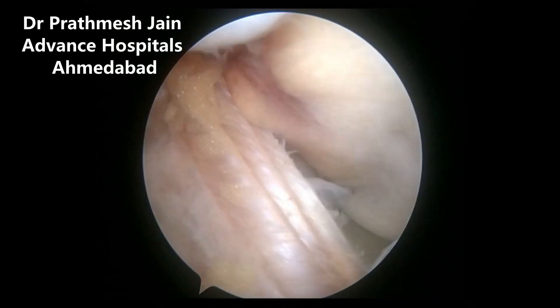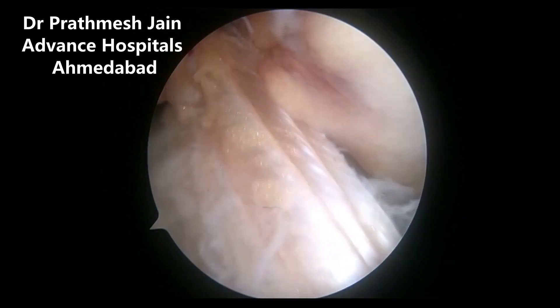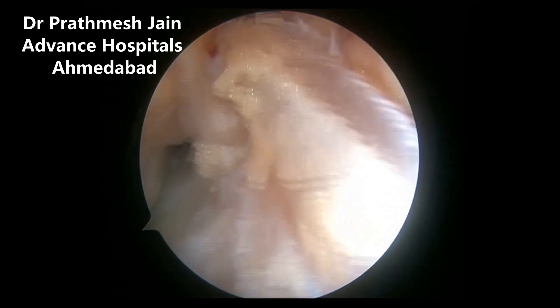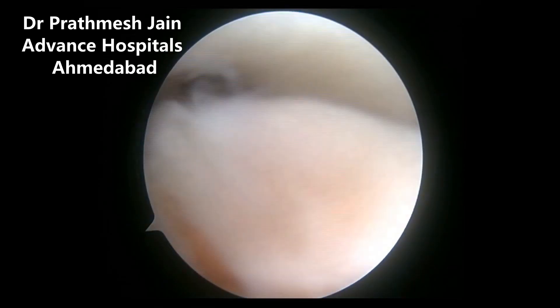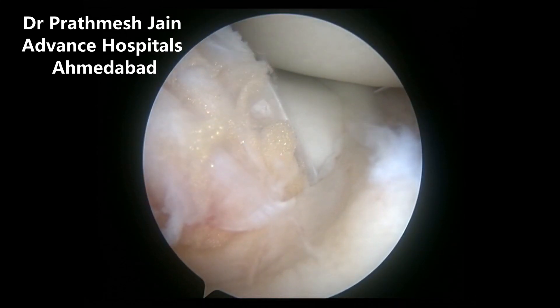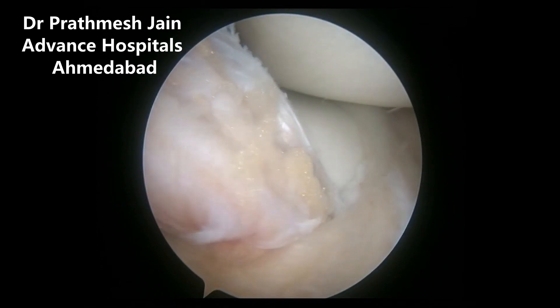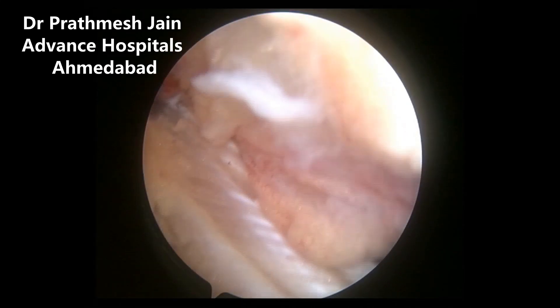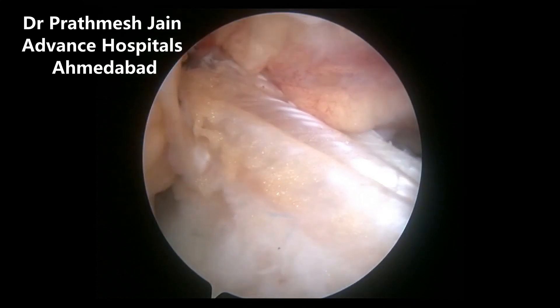Anteriorly, you can stitch it over to a dense or thick periosteum on the tibia, or more commonly I use a SwiveLock anchor to fix it on the tibia to prevent any loosening of this iliotibial band autograft. Here you can see it passing just beneath the intermeniscal ligament; on the femur side it is coming from the posterior lateral aspect of the femur.